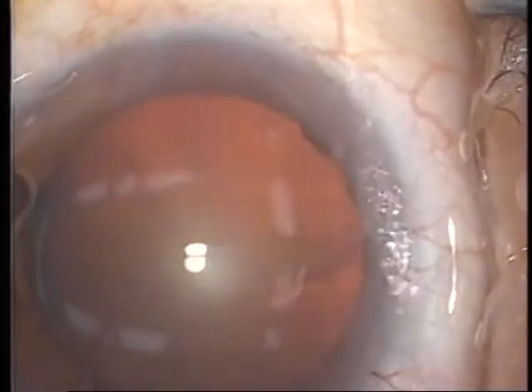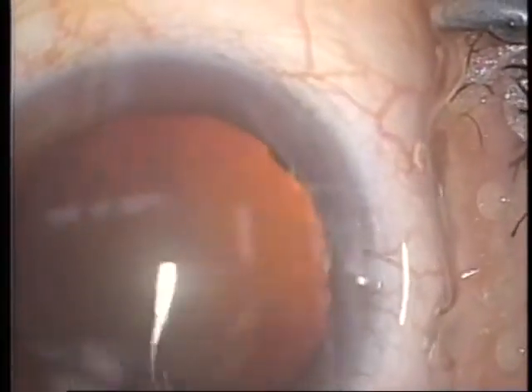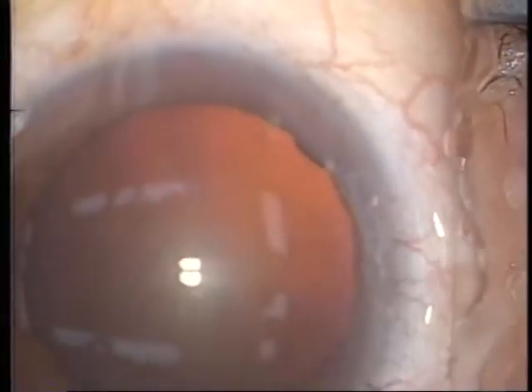For the deep-set eye, however, the trouble remains unchanged because water is pooled and makes it difficult to see.